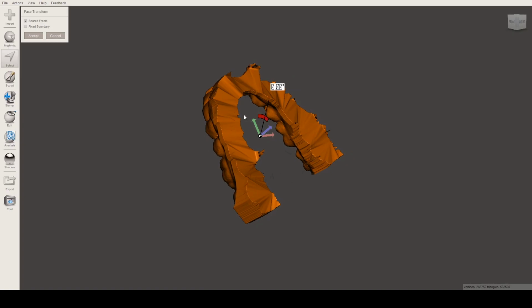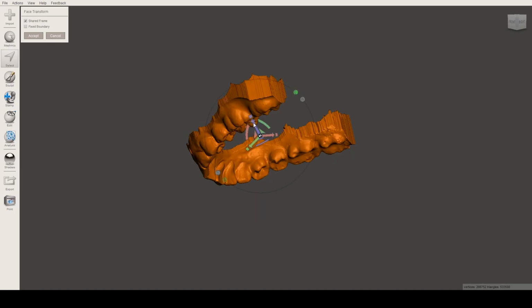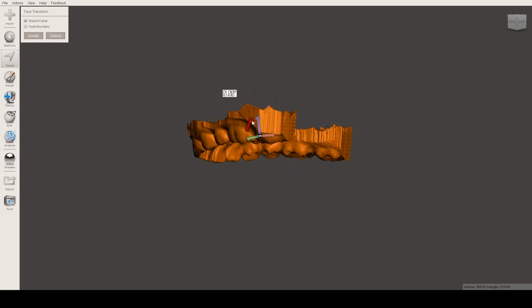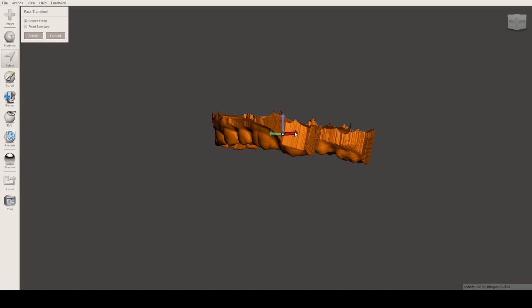It's really slow. Oh, too much. That's too much. Okay. There you go. That's much better. And you can play around with the arrows just so you know how to move your object around. Yeah, the better way to learn how to transform is to really get your hands on the software. So you really need to download it.